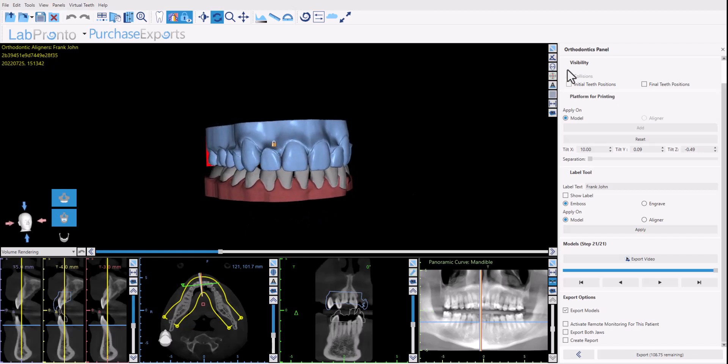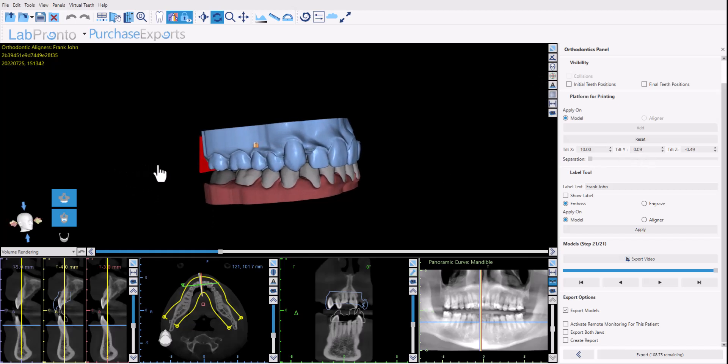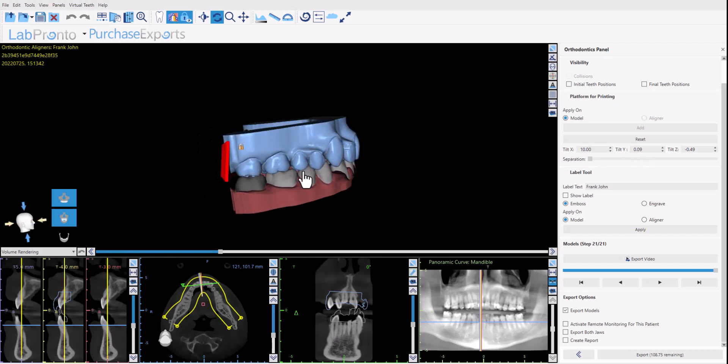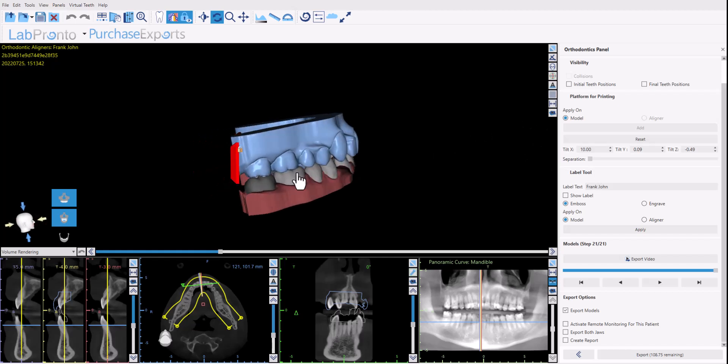So we have checkboxes here for visibility options and then we have the section platform for printing. Now if you're going to be printing the models vertically and you want to add a platform for vertical printing, then this is the relevant section. That's what we're talking about right now.